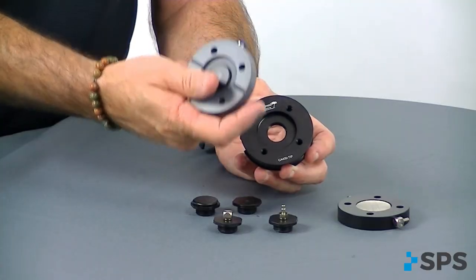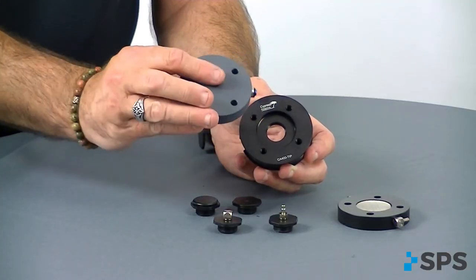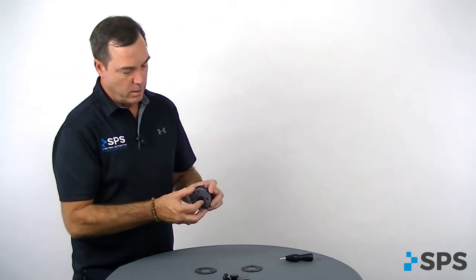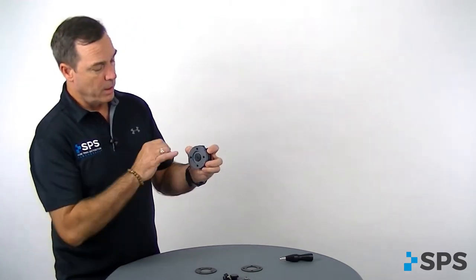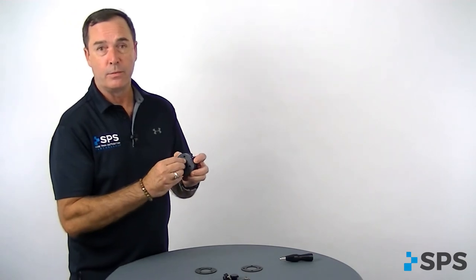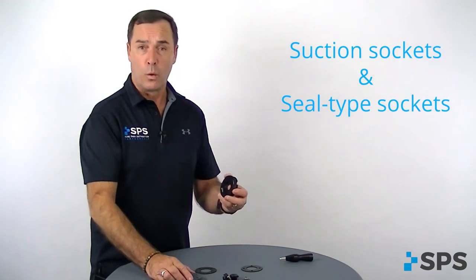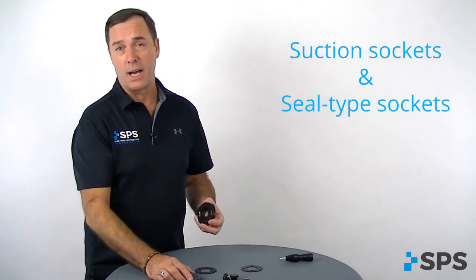We also have the Aria valve plate, which with the gasket would connect directly to and in line with your tie-in plate. That's a one-way expulsion valve with push-button release, and it's good for your suction sockets or seal-type liner sockets.